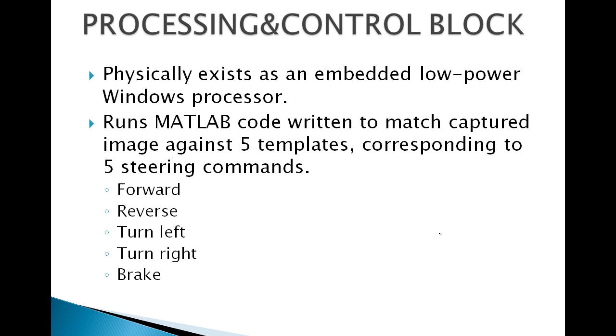The processing and control block consists of the major image processing side of the design. It consists of a Windows processor that is capable of running MATLAB code.